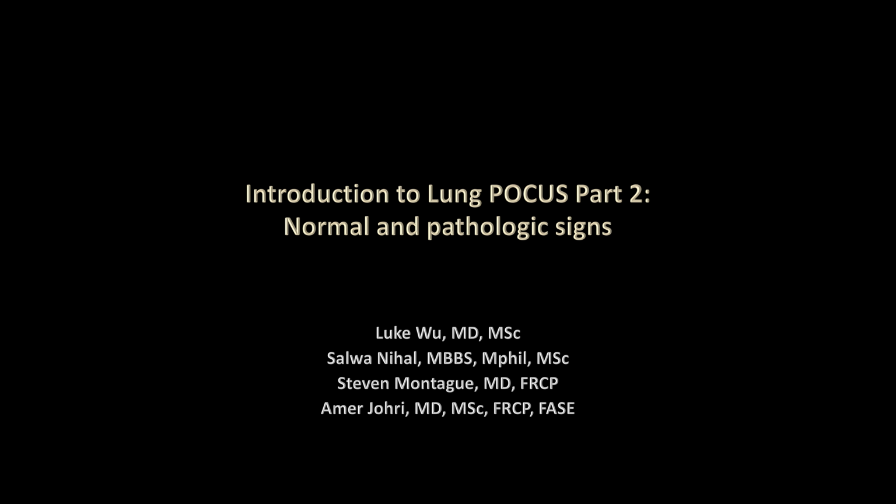Welcome to part 2 of this introduction to lung POCUS. In this section, we will be focusing on normal and pathological signs with a particular focus on pathology.